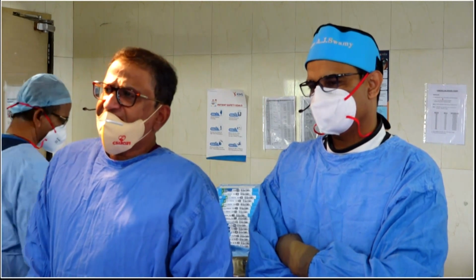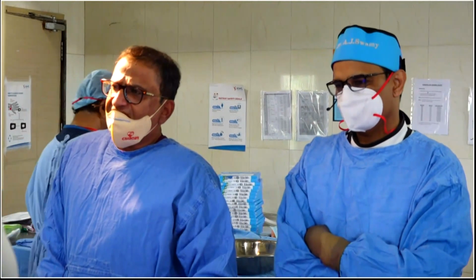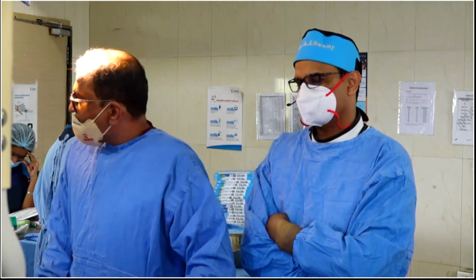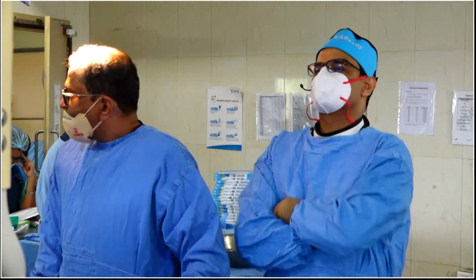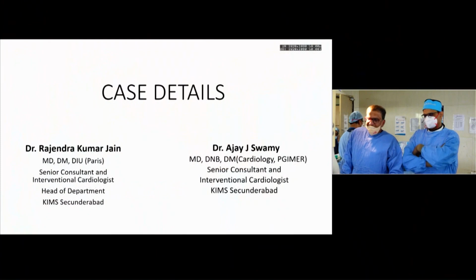The live case we have selected today is a very interesting case. It's almost a no-contrast PCI of the RCA using OCT imaging. Okay, so can you show the slides, please? Here it is. So these are the case details.